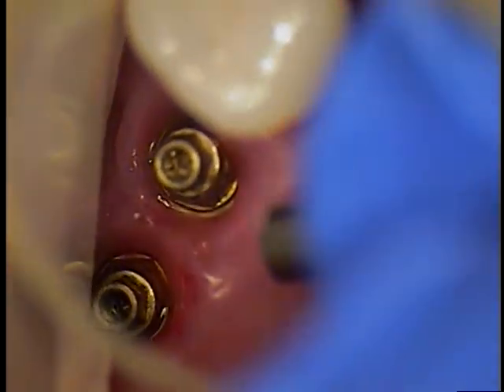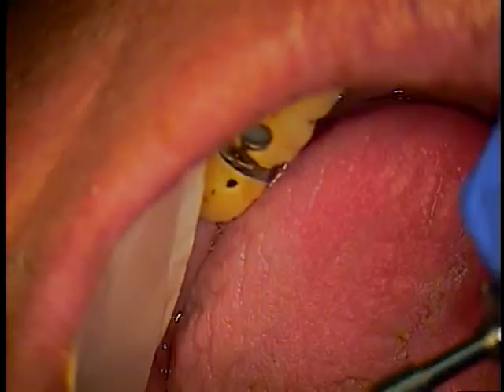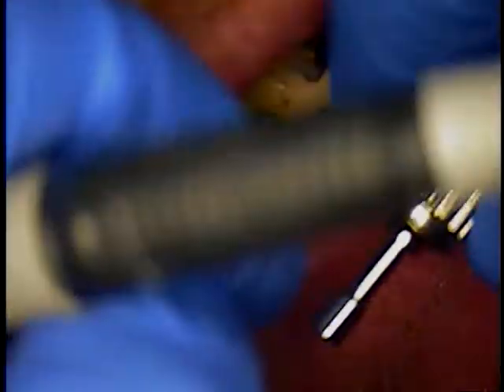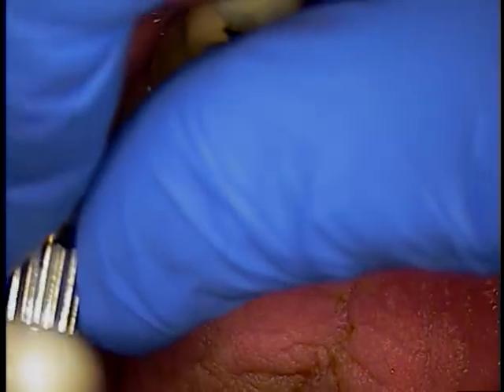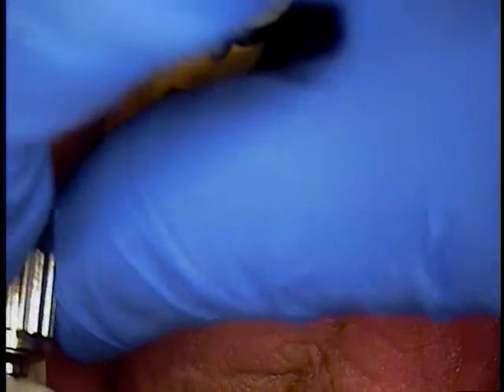Okay, we're back. This looks like an EsthetiCone case from Branemark. A lot going on with this case. So now we've got a hex driver, and that little part on top I have to remove. And then it comes out in segments. So I'm going to go off the camera a little bit here. And let's see if we can get a positive seat. There's the driver seating. Now we're going to back it out.